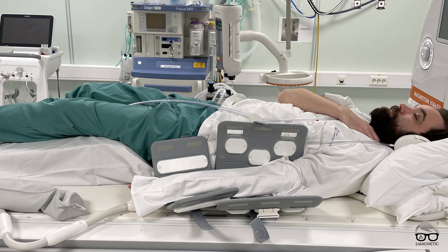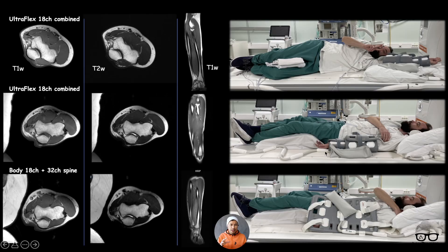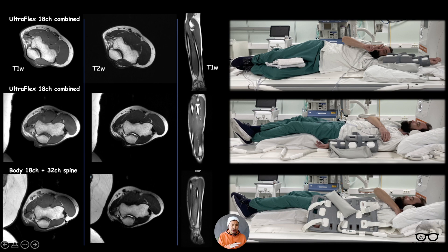I'm using the 18-channel Ultra Flex — one large and one small. When using these coils, do not put the hand directly on the coil — use a cover to prevent burns. Also, when combining the two coils, wrap the small one first and then wrap the big one on the outside for good overlap. As for the Body 18 coil, not everyone has the Ultra Flex, so I tested whether it could handle the same image quality with these parameters.